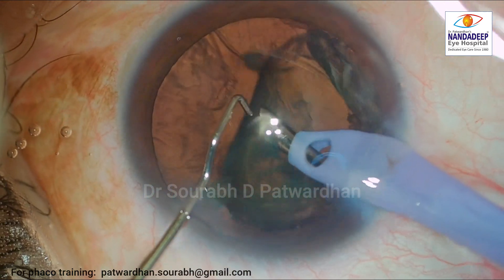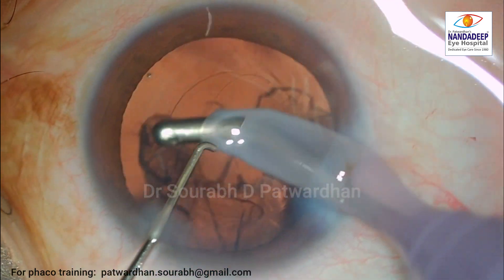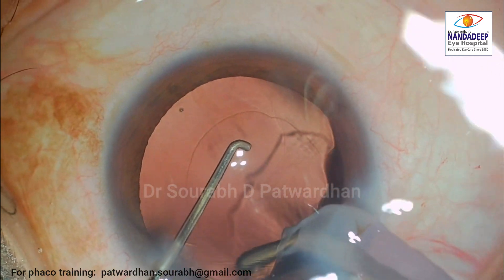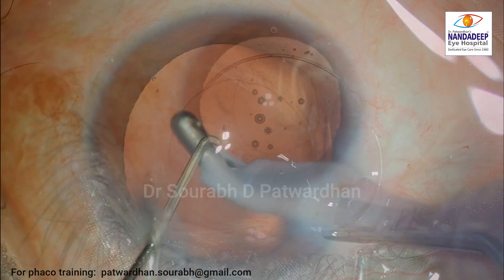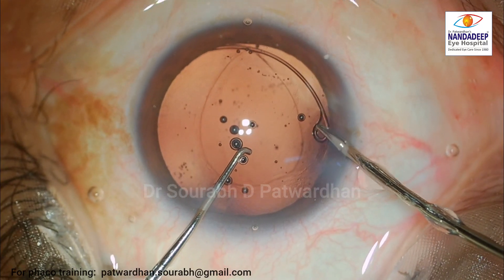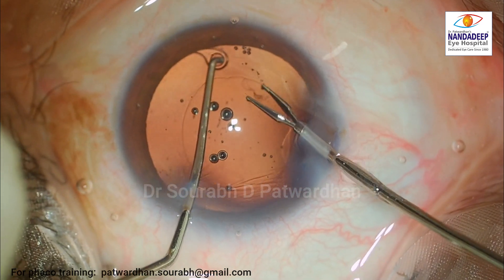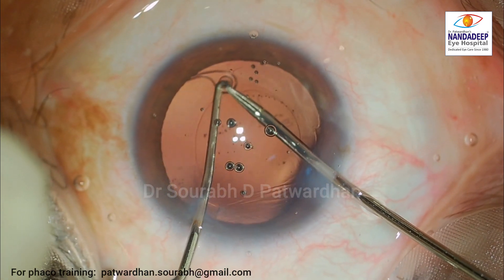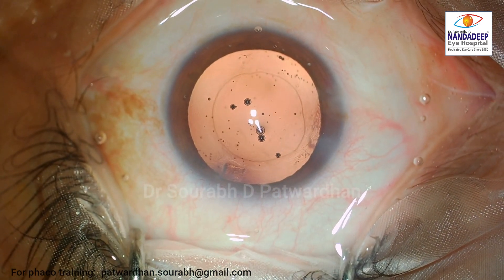This is an elderly lady with high myopia and I have planned an extended depth IOL of 10 diopters. For eyes with axial length more than 26 mm and with a large bag size, I generally put a capsular tension ring. This helps in good centration of the IOL long term, and I find the refractive error is more minimal and predictable. It stretches both the anterior and posterior capsule and makes the IOL snugly fit in the bag.